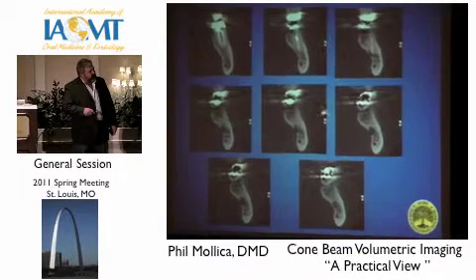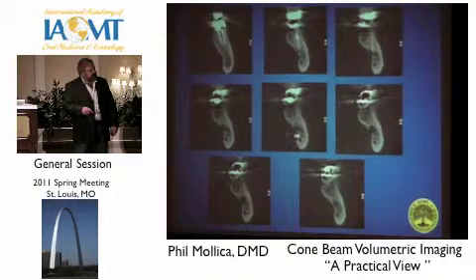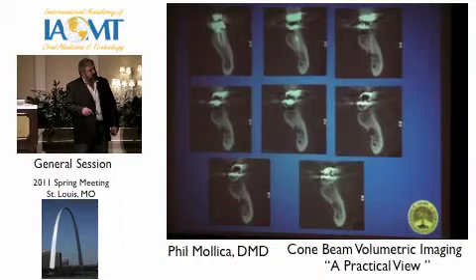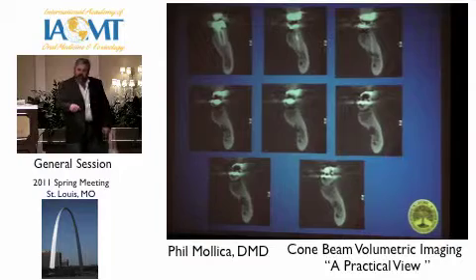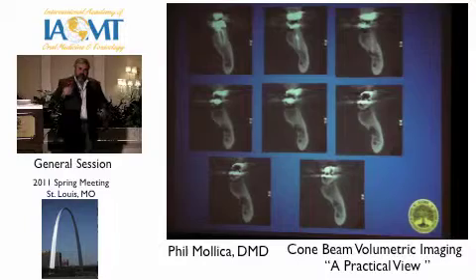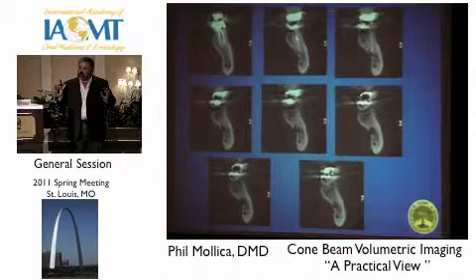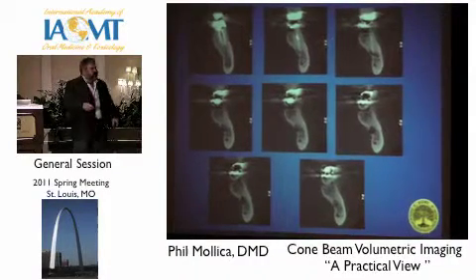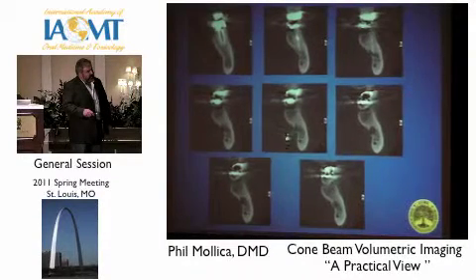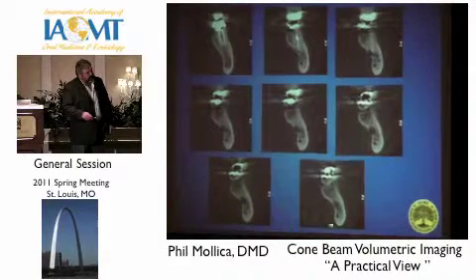Look, as we're going through the tooth distally, we're seeing it's perforating the lingual plate, the infection. We go further back. Now, we see it even going here. Now we're starting to see the molar behind the root canal itself. So now when you're thinking about it, we're not thinking two-dimensionally on this infection, but it's a three-dimensional picture you're starting to put together associated with this infective state. So now we're seeing the extent of this infection coming off this particular root canal, breaking out the lingual plate of the bone, extending down and infecting all the way down. This is where you could possibly get some of this neuralgic type of pain.